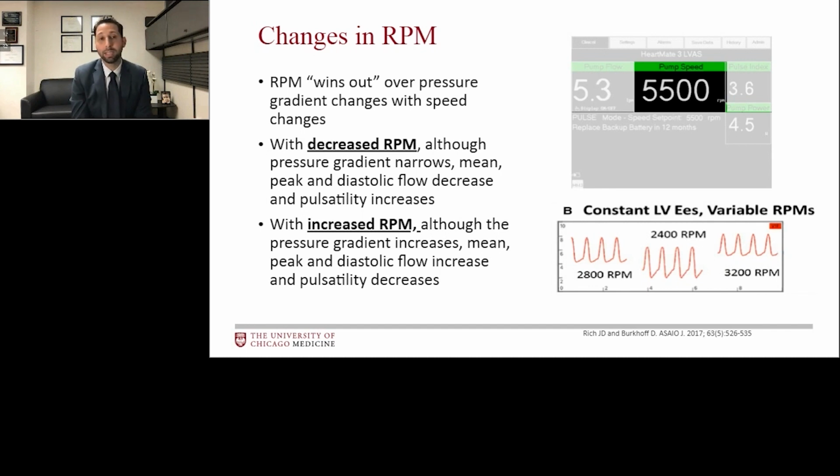So at first glance, you say, okay, I've already told you that if you increase the RPM, you're going to increase flow. And if you decrease RPM, you're going to decrease flow, which is true. If you focus on just the RPMs themselves, that is true. But the pressure gradient is also going to change as the RPMs are changing.